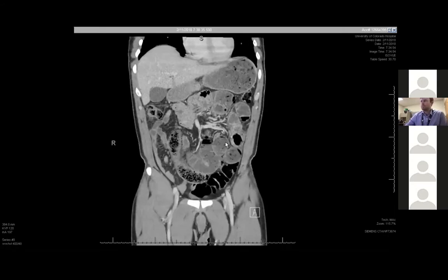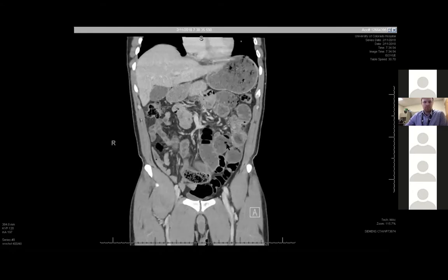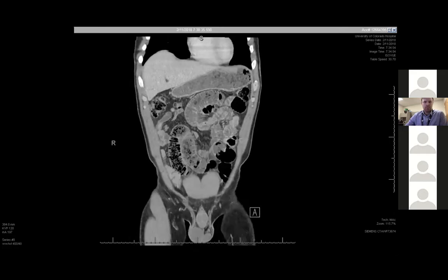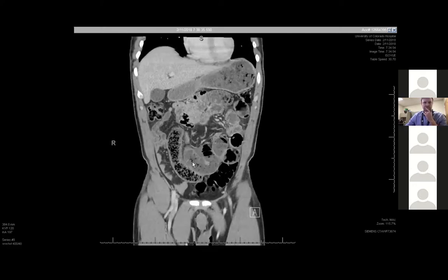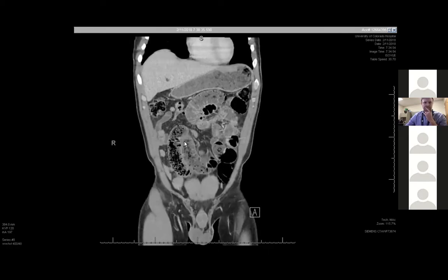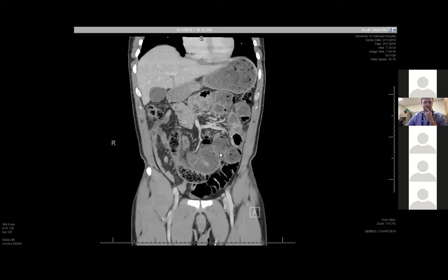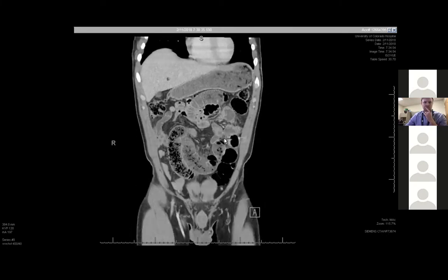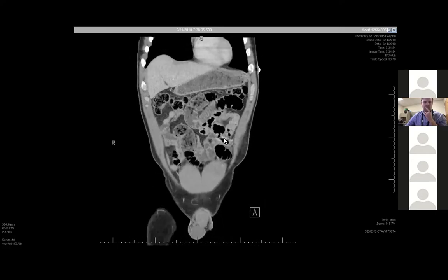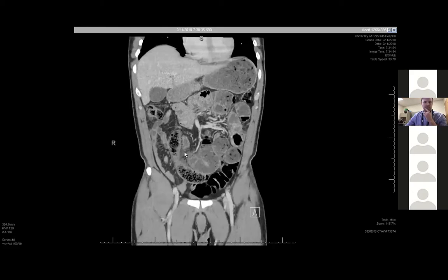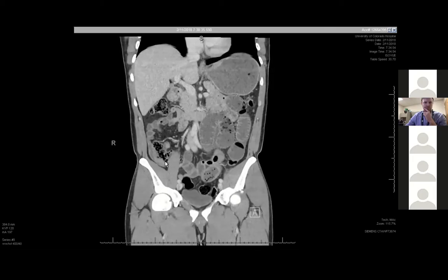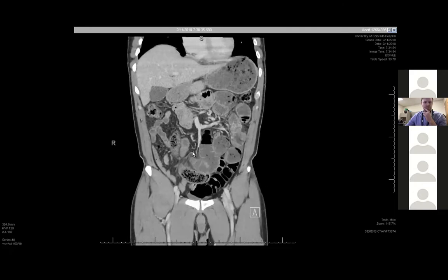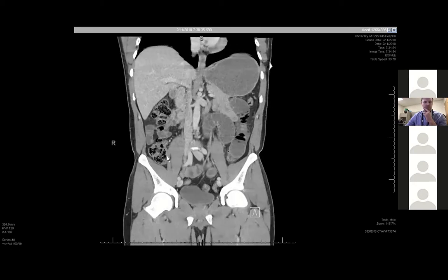Our first branch point is: is this ileus or obstruction? Because they have different managements. I'll follow one of these loops of bowel and try to find a transition point, then follow it back the other way to make sure there's no other transition point suggesting a closed loop or internal hernia. Coming over by the colon, here's the cecum, and I'm seeing the ileocecal valve right here and distal ileum — that's all decompressed. So I know there's some obstruction above this, and it's not related to the colon just being backed up or to an ileus.